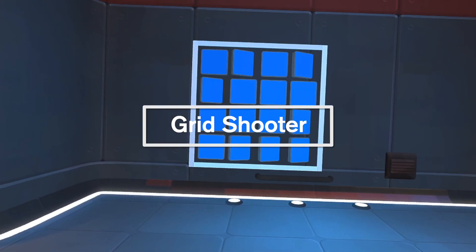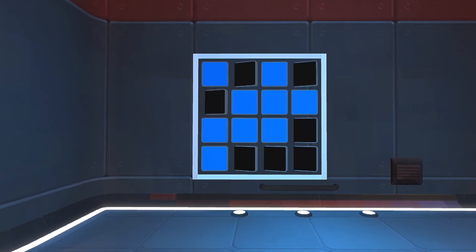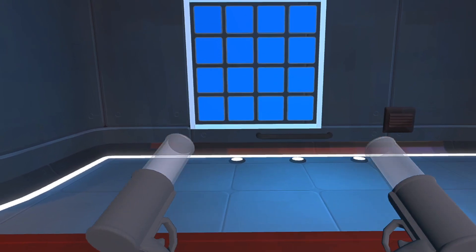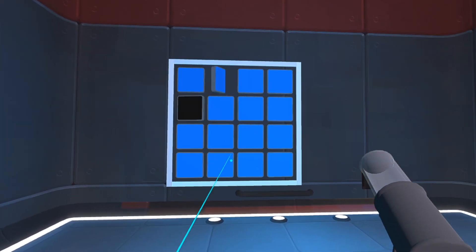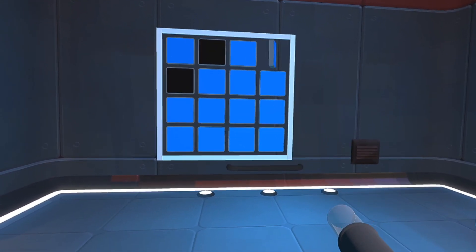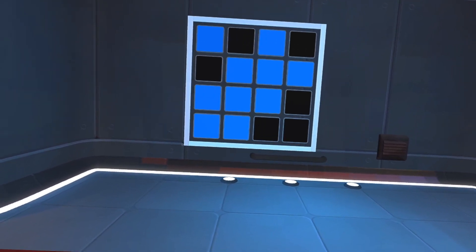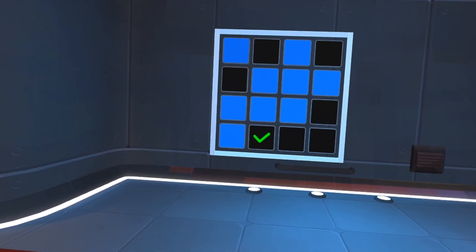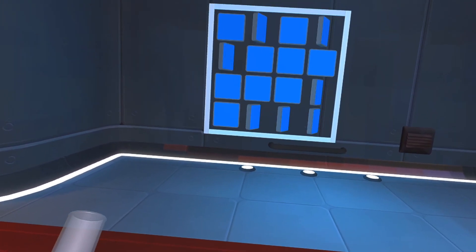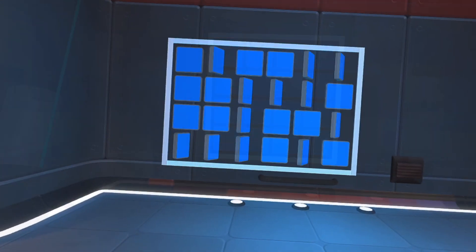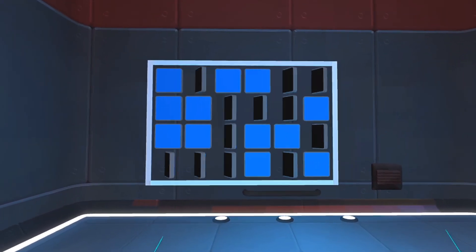The next activity is Grid Shooter. This is a visual memory activity. You'll be shown a grid pattern and using your pellet guns, you'll need to replicate the pattern by shooting the tiles. The Easy, Medium and Hard settings increase the number of tiles you need to memorize.